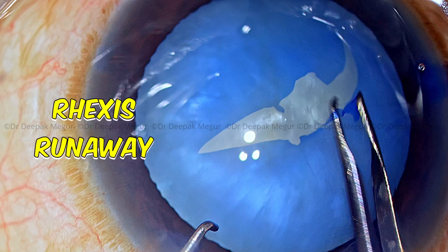Let's go to another case which is an intumescent lens but it doesn't have any pockets of fluid — the entire lens cortex is swollen and I expect a difficult rhexis. The precaution I've taken in this eye to ensure the eye is soft: I've given preoperative IV mannitol so that it shrinks the vitreous and there is less positive pressure. One thing I haven't done is block the eye, and the patient is moving his eyes a lot — he's very anxious, and this is not a good way to handle this case. Apart from using IV mannitol, I've stained the capsule well and I'm using a heavy OVD to flatten the capsule well enough.